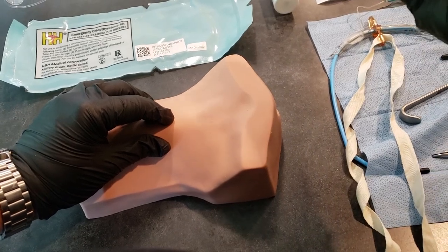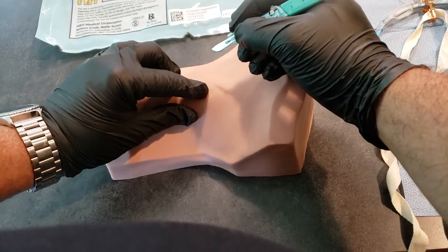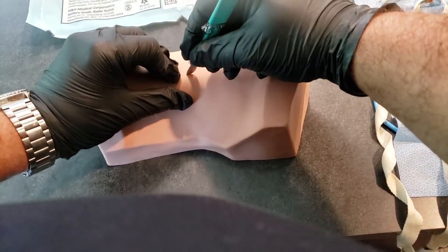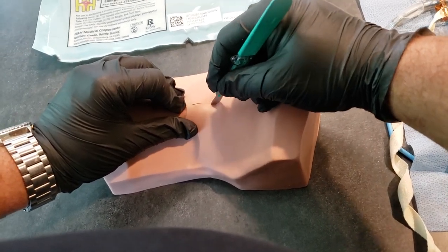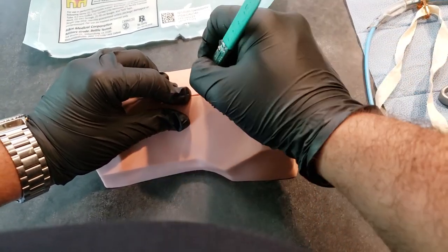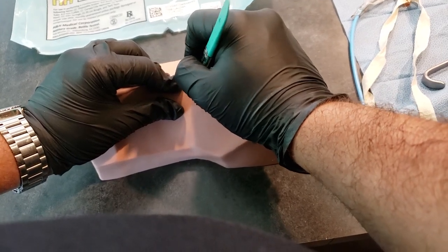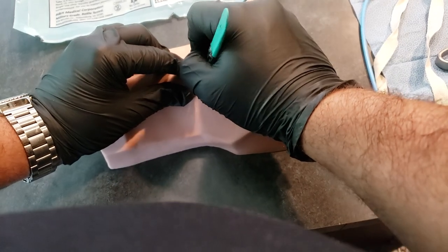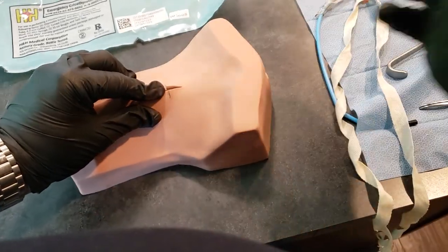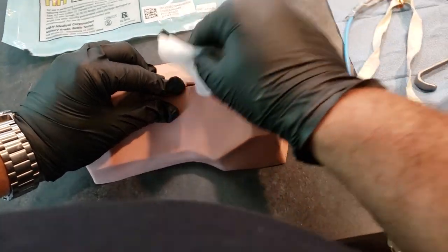You'll use your number 10 blade scalpel and make a two to three centimeter vertical incision, and then a one and a half to two centimeter horizontal incision through the cricothyroid membrane. At this point, you may need to use your gauze or the kelly forceps to stop any bleeding.